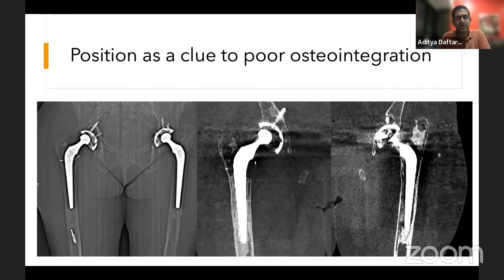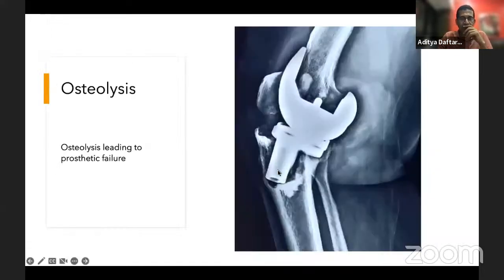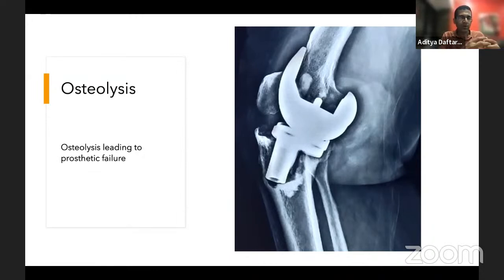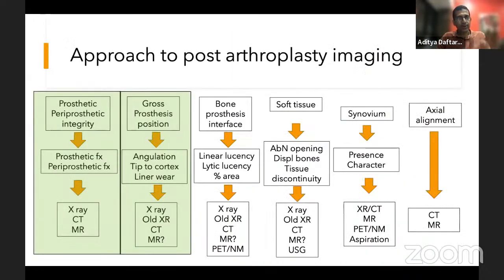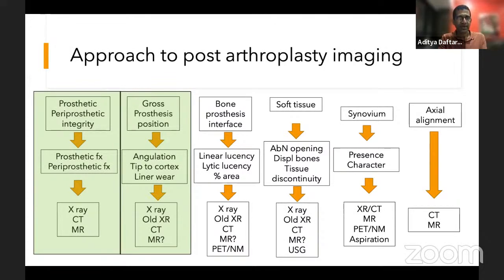Here's another patient with osteolysis where the prosthesis is actually subluxed and coming out — completely loose. The osteolysis or poor osteointegration has gone along the entire surface area of the prosthesis. To summarize the second part: look at prosthesis position, compare to old studies, and look for sclerosis or lucencies to determine whether failure is from abnormal stress or poor osteointegration.